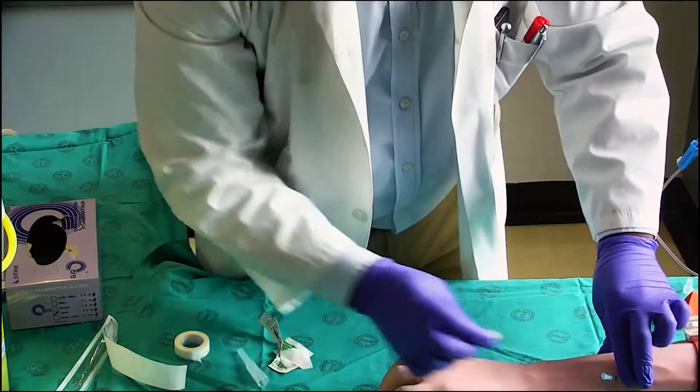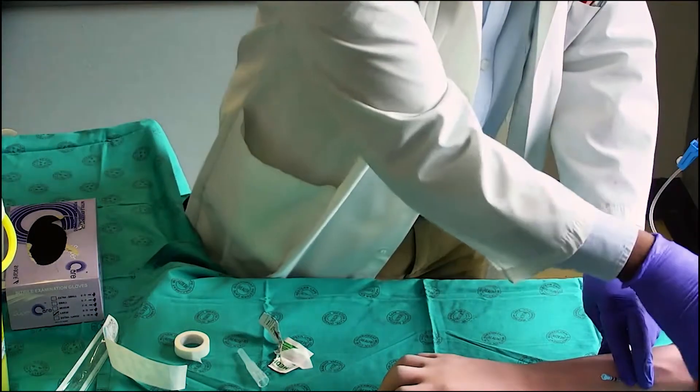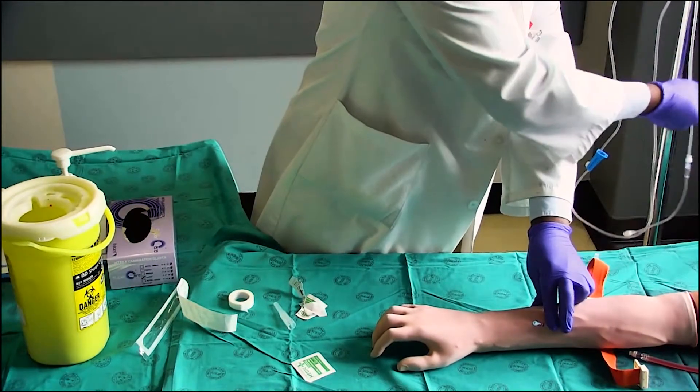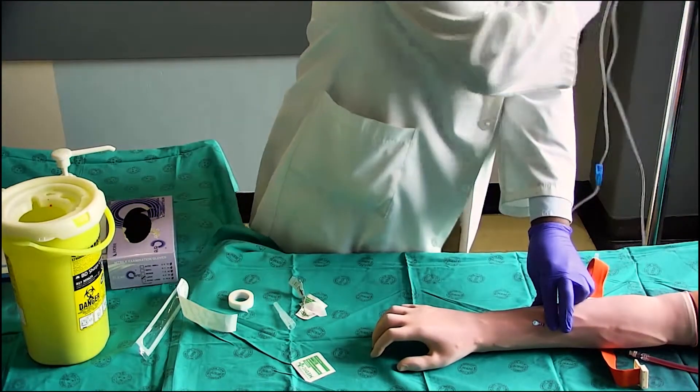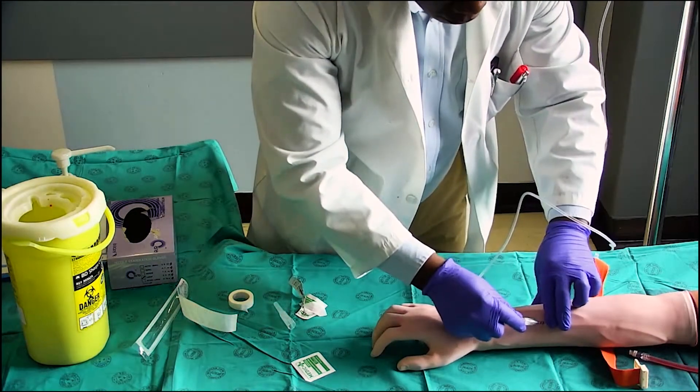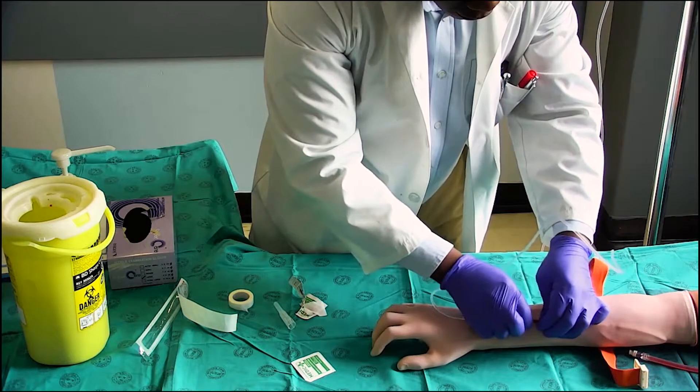Apply pressure to the vein to stop blood flow and remove the needle from the cannula and discard immediately. Release the tourniquet with the other hand. Connect the intravenous infusion to the cannula whilst maintaining the sterility of the tip of the set that you are attaching to the intravenous cannula.